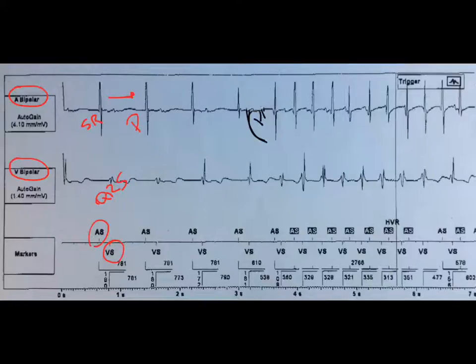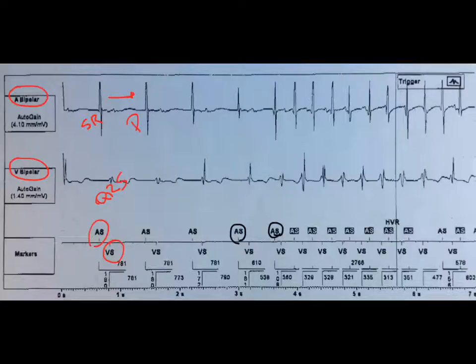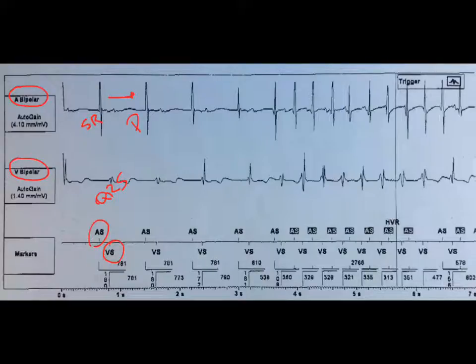The other question is, during the rhythm, are there more P waves or A waves — A for A sense — or more A waves or V waves? In a quick look, it looks like almost more A's. So let's look at this: one A wave, one V; one A, one V; one A, one V; one A, one V; one A, one V.